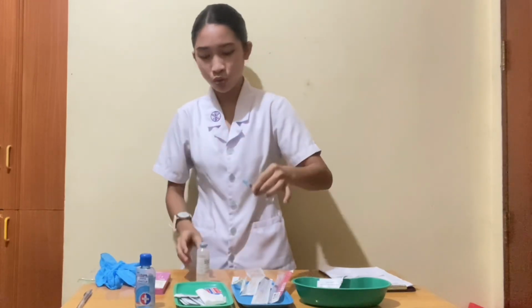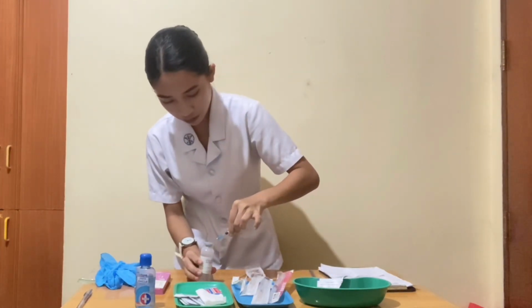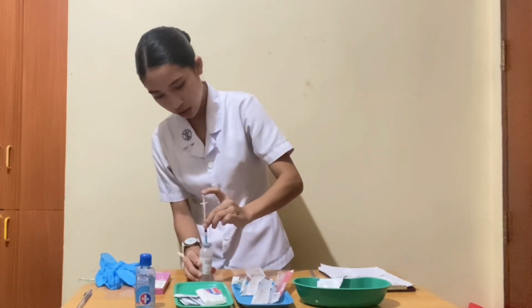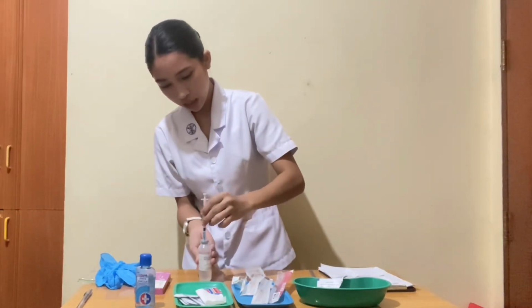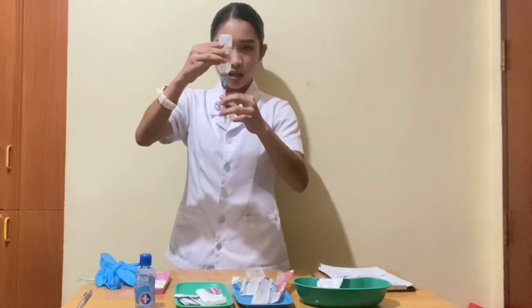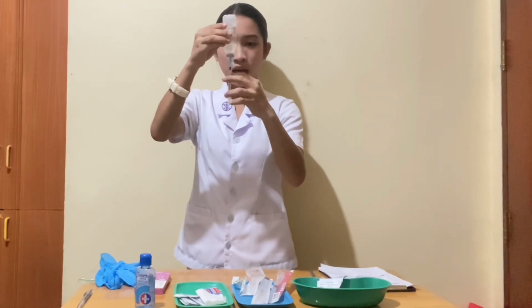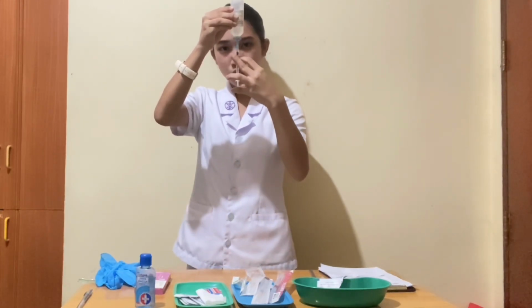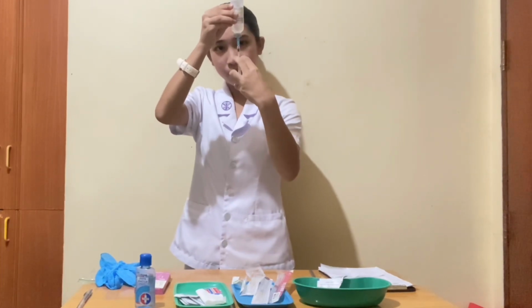Make sure to keep the bevel up and draw the air, and then invert the vial like this and draw the exact amount of sterile water, which is 0.1 ml.